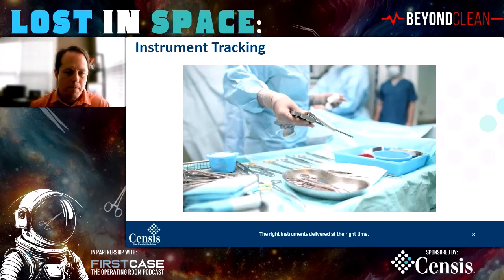So that was really the genesis for the idea here. We got data today and historical data about what was being assembled into trays over some period of time. Most instrument tracking systems can interact with your OR schedule as well to prioritize workflow, figure out what trays are needed for upcoming cases to assist with case picking.